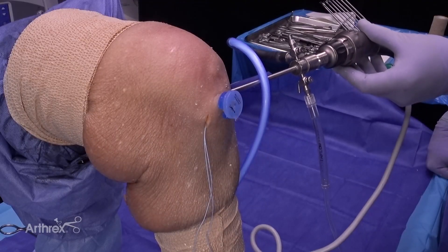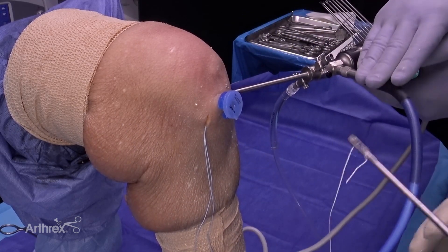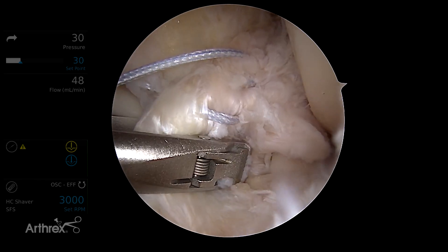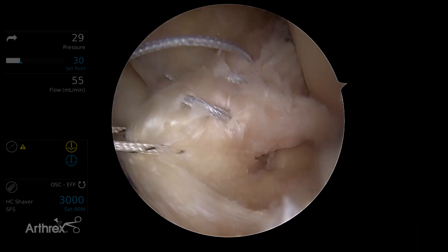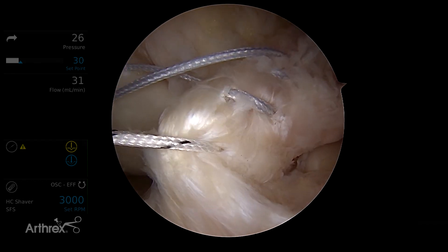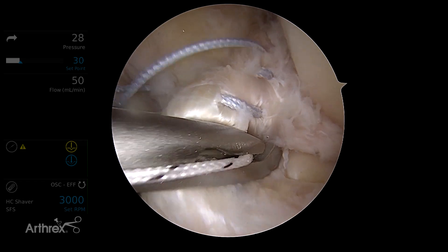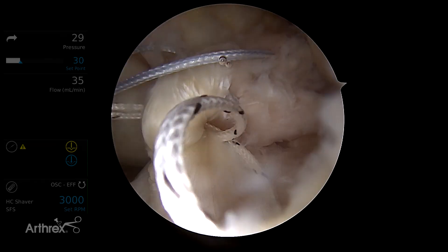Once we've parked both sutures out the inframedial portal, we can go about suturing the posterolateral bundle. We're going to start low, and this time we're going to use a tiger wire for good suture management. We'll take a low bite and come through the PL bundle. There's usually some robust tissue here on the PL bundle and it tends not to come apart as much because it's protected by the AM bundle. We'll come back and forth like we did for the AM bundle, and then exit — this time both limbs towards the wall, because we want to pull that PL bundle right up against the wall with our anchor.